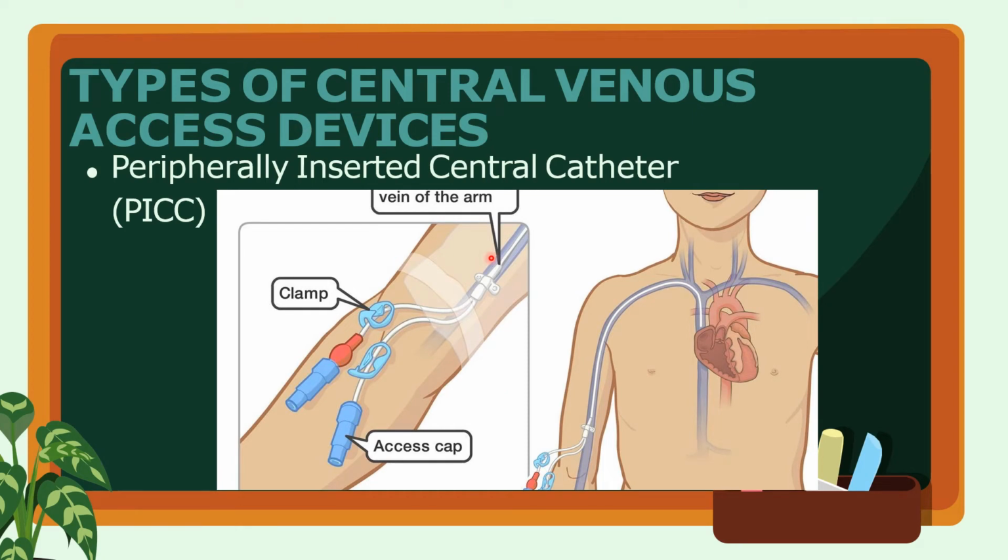So, the peripherally inserted central catheter line gives your doctor access to the large central veins near the heart. It's generally used to give medications or liquid nutrition. A PICC line can help avoid the pain of frequent needle sticks and reduce the risk for irritation to the smaller veins in your arms.